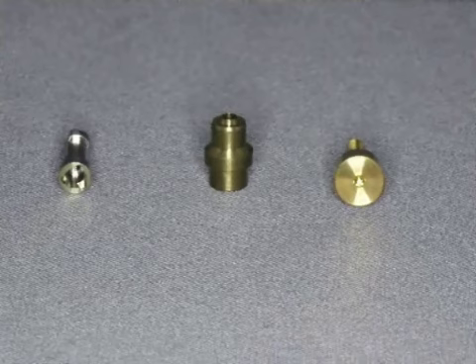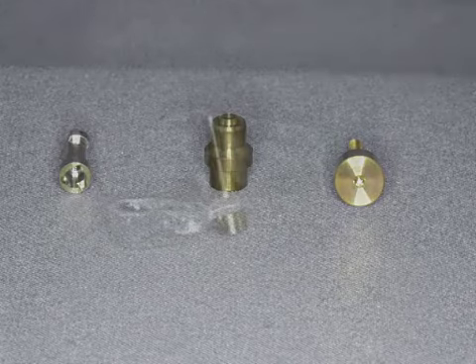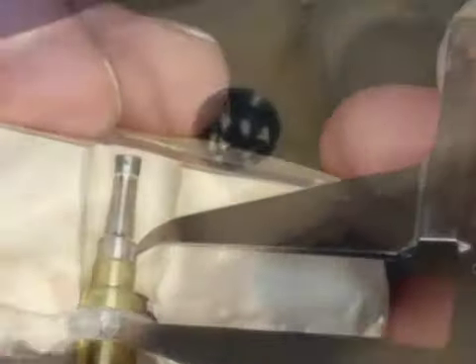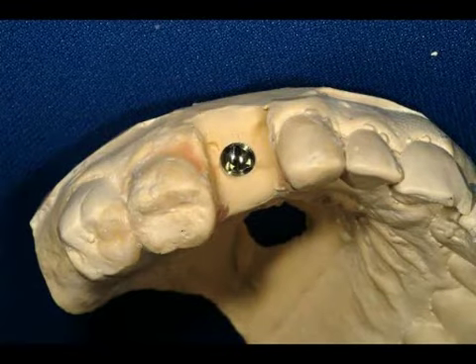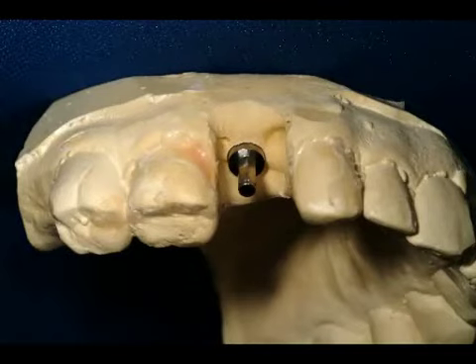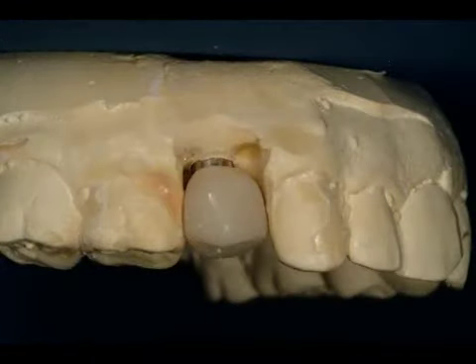So on the left you see the implant analog or implant replica, and the other two parts are used to attach this to the surgical guide in order to retrofit the analog back into the original study model, thus allowing you to fabricate a master model that will be used for designing the prosthesis. So here is this patient's original study model with an implant analog retrofitted back in, and then I'm going to use a Nobel Replace immediate provisional abutment and secure that into the implant replica. I then took the provisional crown that the patient's dentist made, and I fitted that onto the coping that goes over the immediate provisional abutment, being sure that it was positioned so that it was completely out of occlusion when it was seated.